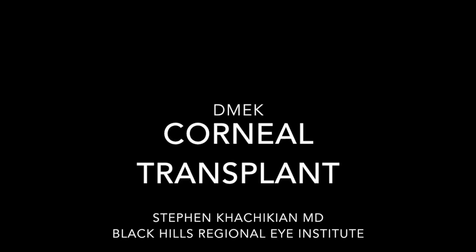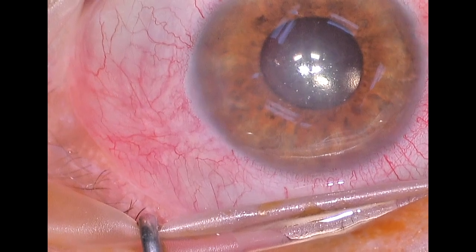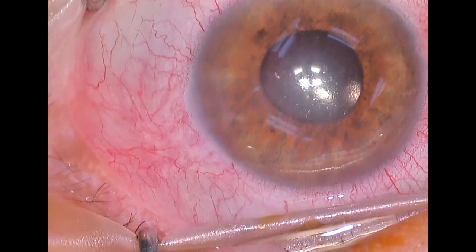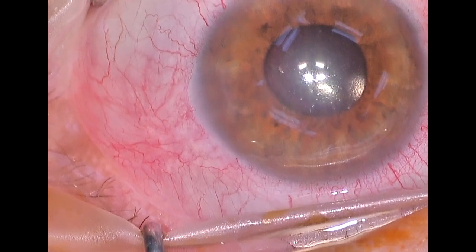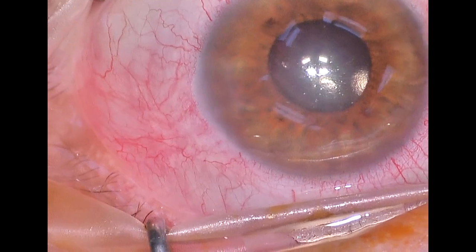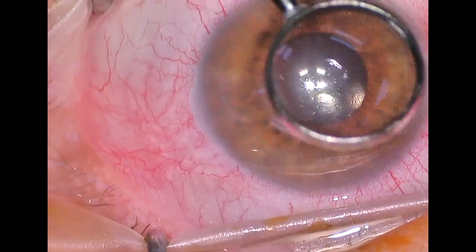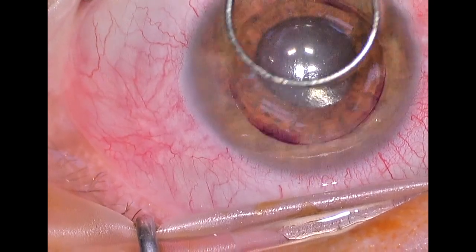This is Dr. Stephen Kajikian of the Black Hills Regional Eye Institute, and this is a video of a partial corneal transplant. The transplant is called a DMEK, or Descemet Membrane Endothelial Keratoplasty, and really what we're doing here is we are transplanting the innermost layer of the cornea.